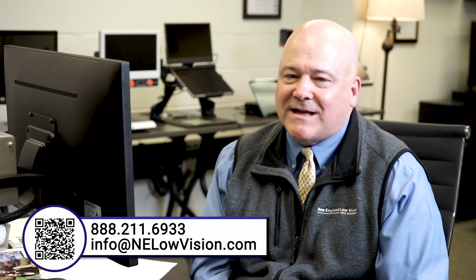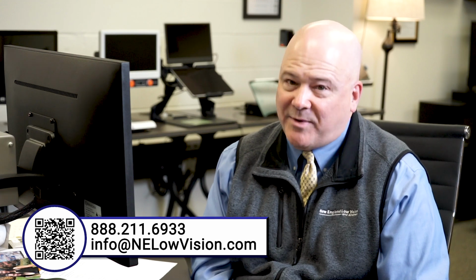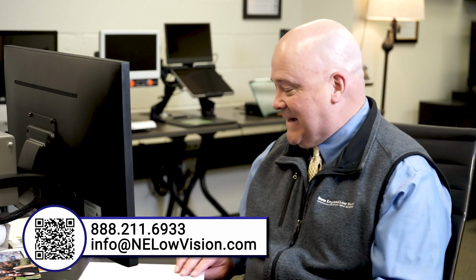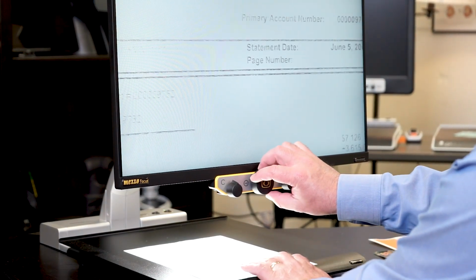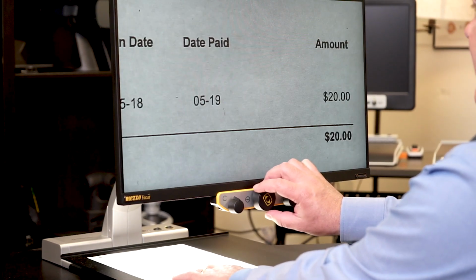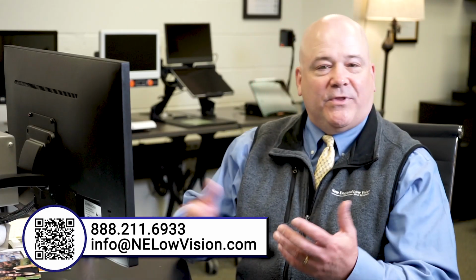Okay, so one of the next things I want to show you is how to identify and read the amount you owe on a bill. Very important part of our daily activities is how much do I owe on this bill, and maybe when is it due. So I take the bill, and I might reduce the size on here. It'll show up on screen. I'm going to look down toward the bottom, and the amount due is $20. So there you go.